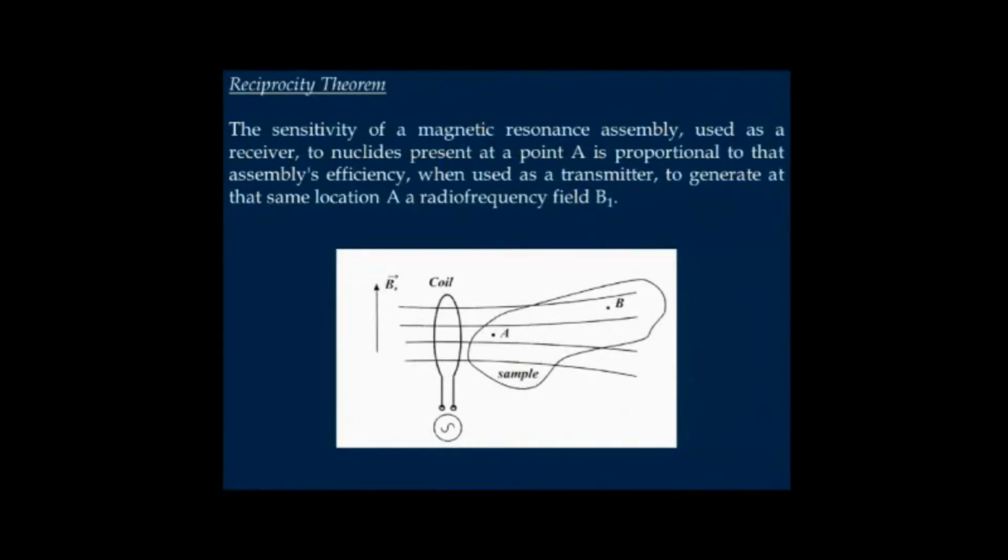This means, on the other hand, that nearly everything I'm going to talk about in the following is valid for both, for transmit coils as well as for receive coils. So I will not, in general, make a big difference there.